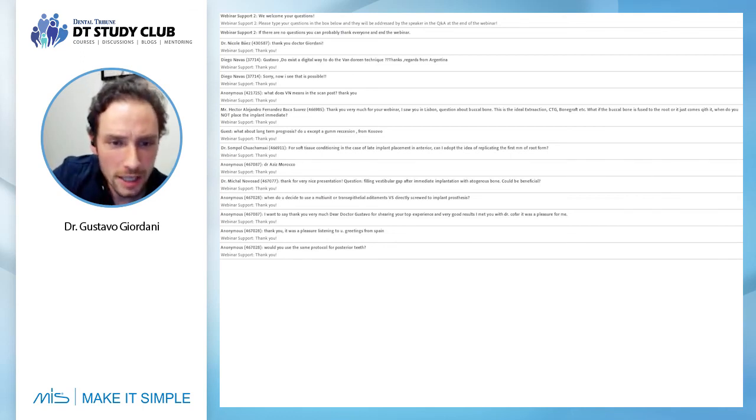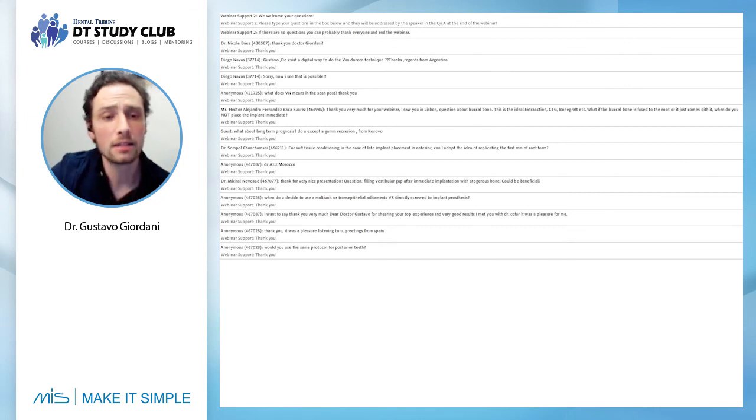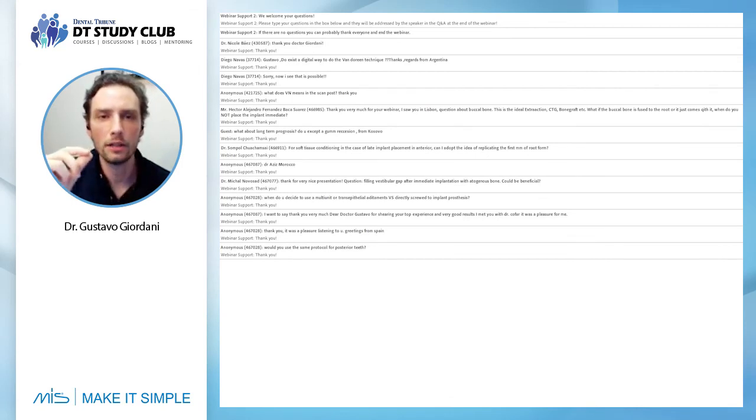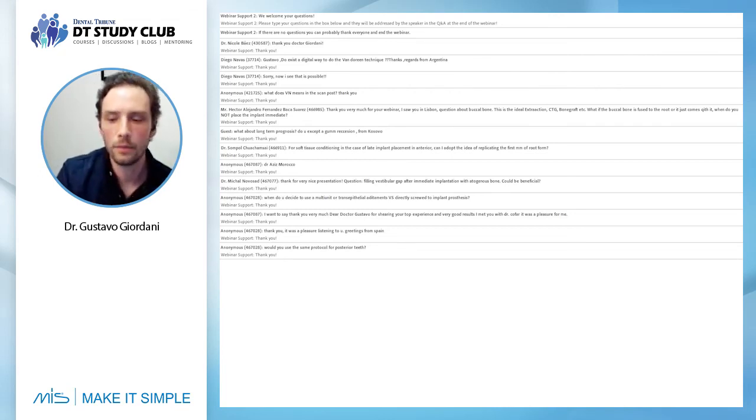What else? Do you decide to use multi-unit or transepithelial versus direct? Yes, I'm using now more and more the Connect. The Connect is a very good tool from MIS, a very good component to try to use, as much as you can, the concept of one abutment one time. So we are now trying as much as we can not to unscrew and screw all the time. By using the Connect, which is a very nice component that you screw on the same day of your implant placement, you put the implant subcrestal, you put the Connect, you torque it.